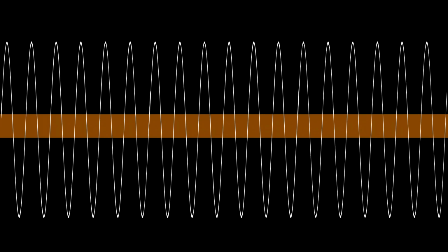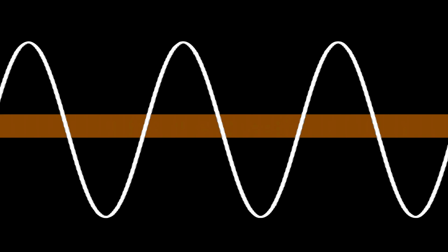However, it will have interacted with that tissue in multiple areas and give you a better resolution. With the lower frequency, we'll have less resolution because there's less interaction with the tissue, but with that less interaction, there will also be less attenuation and the sound beam will penetrate deeper.